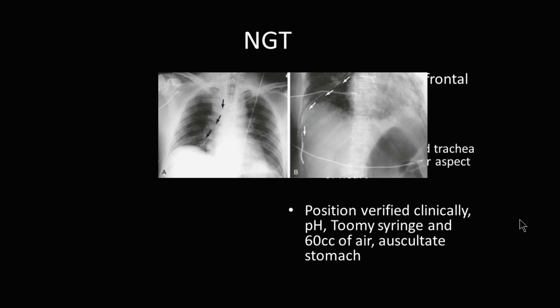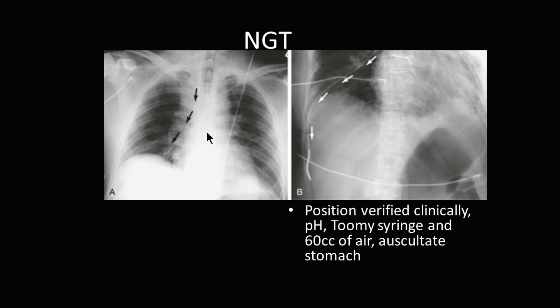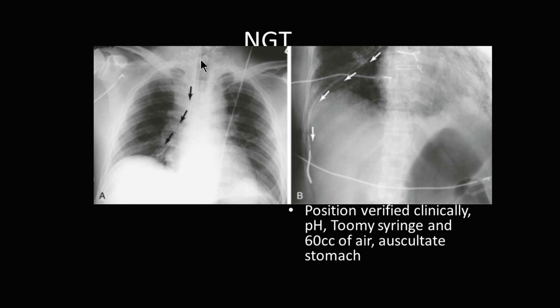When it's not placed correctly, this NG tube appears to be coming down what might be the esophagus. However, you see it takes a diversion here off to the right-hand side. In fact, this NG tube went down the right main stem bronchus, probably because the patient coughed or has some anatomical variation that allowed the NG tube to bypass the epiglottis and come down into the lung.